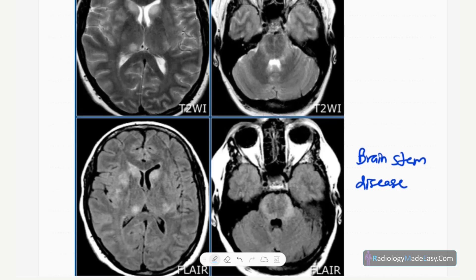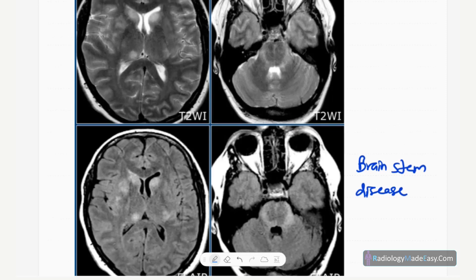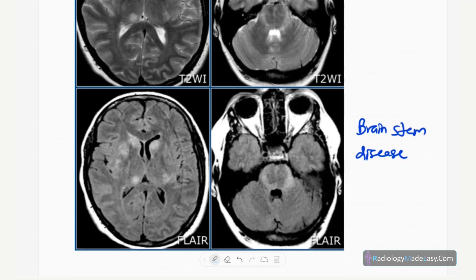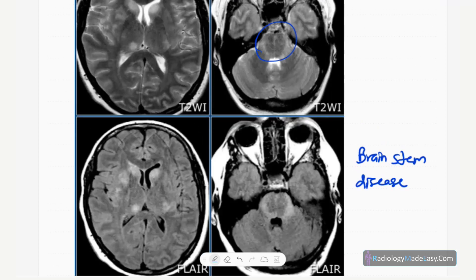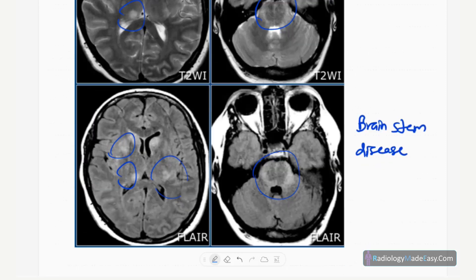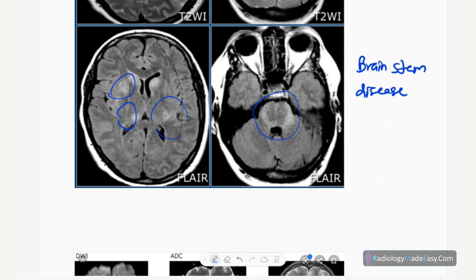This is another presentation: brainstem disease. On T2-weighted and FLAIR images you can see involvement of the midbrain and also deep periventricular deep white matter. Brainstem disease is another presentation, and sometimes optic nerve involvement can also be seen.